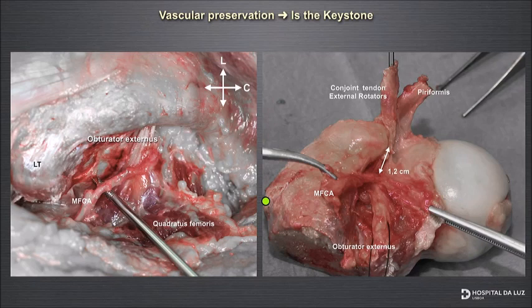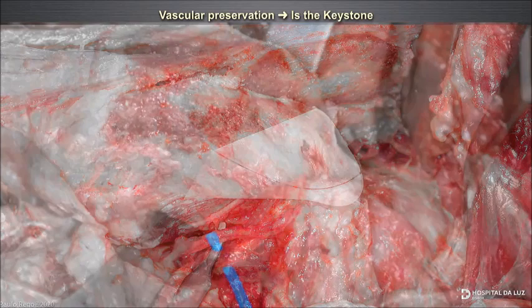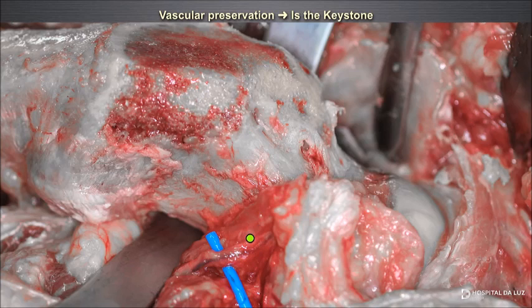Sometimes you need to remove all the posterior bone of the trochanter; sometimes you don't need to remove all the bone. But you need to expose the femoral neck 360 degrees around. This is the deep branch of the medial circumflex artery, protected by this retractor and included in a soft tissue flap that you can develop with visual control.